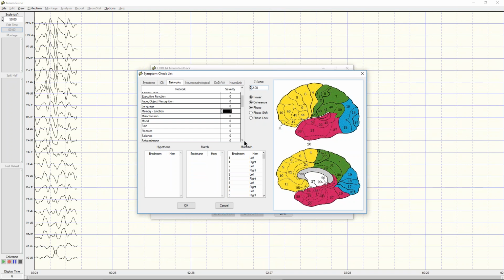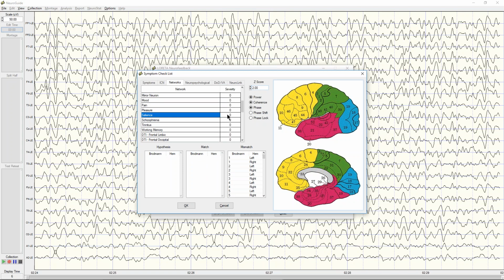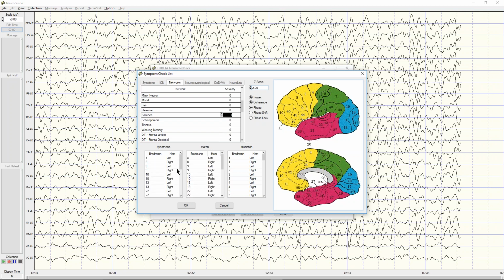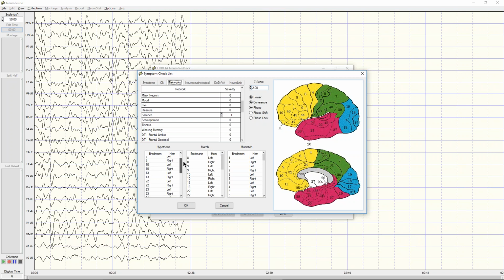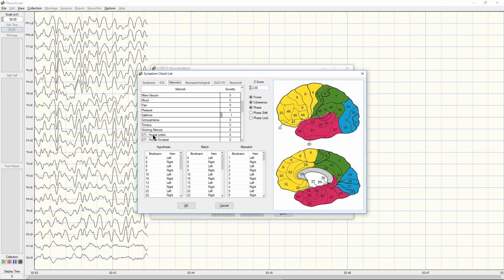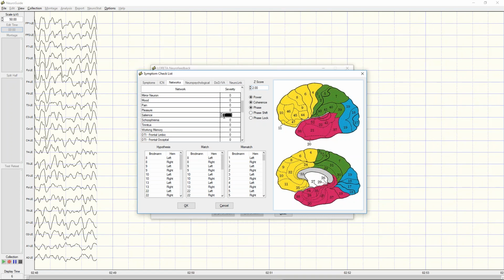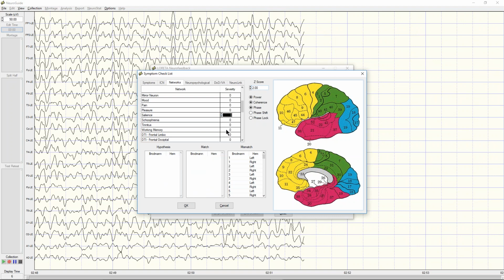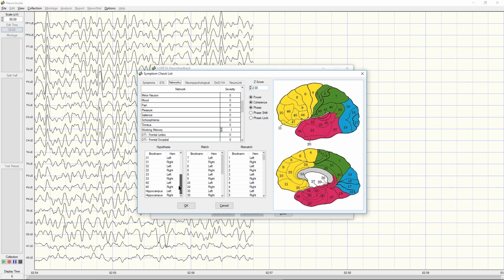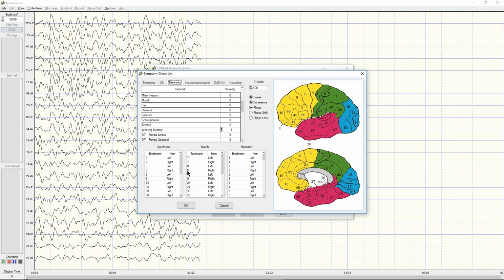We have a difficult time with switching functions, for example. So that's the salience network, switching her awareness from one thing to the next. Again, we have a hypothesis of all these areas should be affected, and in her case, they are affected. So that would be a good choice as well. She's got some working memory issues, so we could choose the working memory network. And again, we have lots of matches. And that might be the best choice of all. So let's start with that.